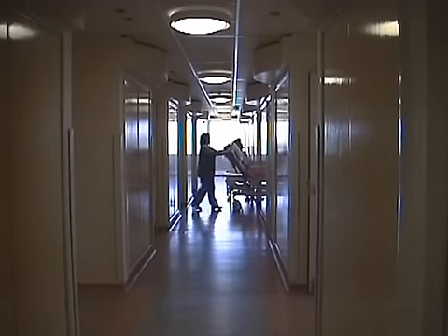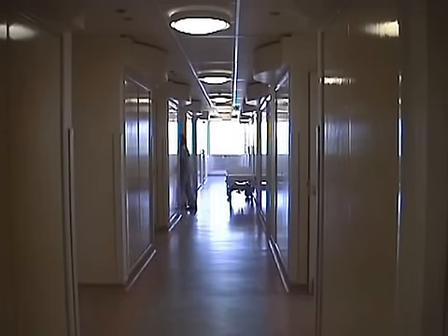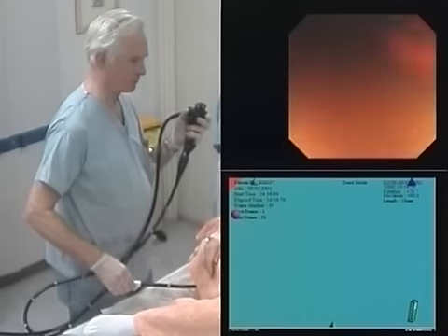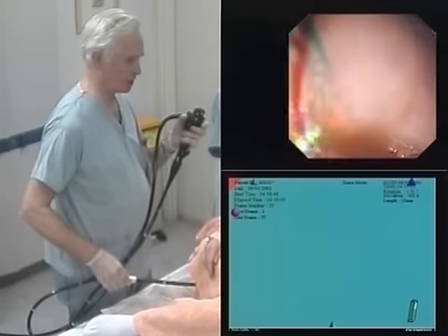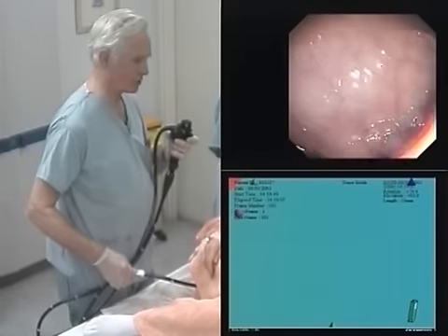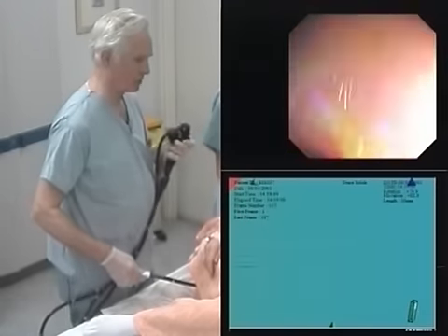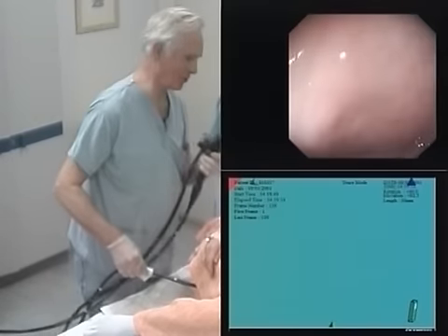Abigail, who I'm examining, is from a polyposis family. I chose the innerflex variable colonoscope for her because she had a very long colon and an extremely difficult colonoscopy three years ago. Her preparation was with Senna and magnesium citrate. Her medication was 2 milligrams of midazolam, 50 milligrams pethidin and buscopan.